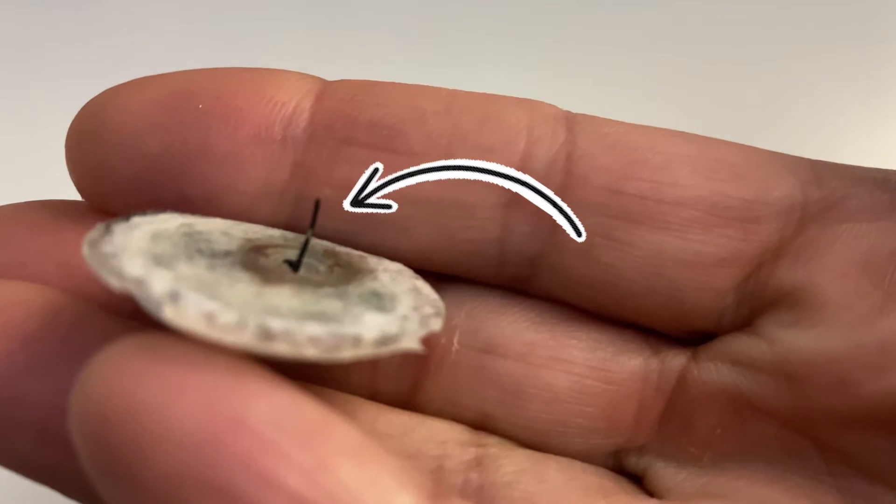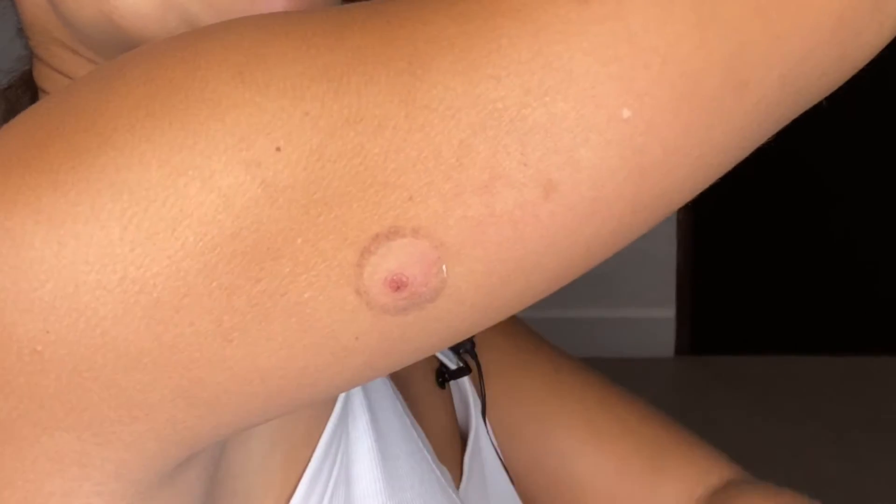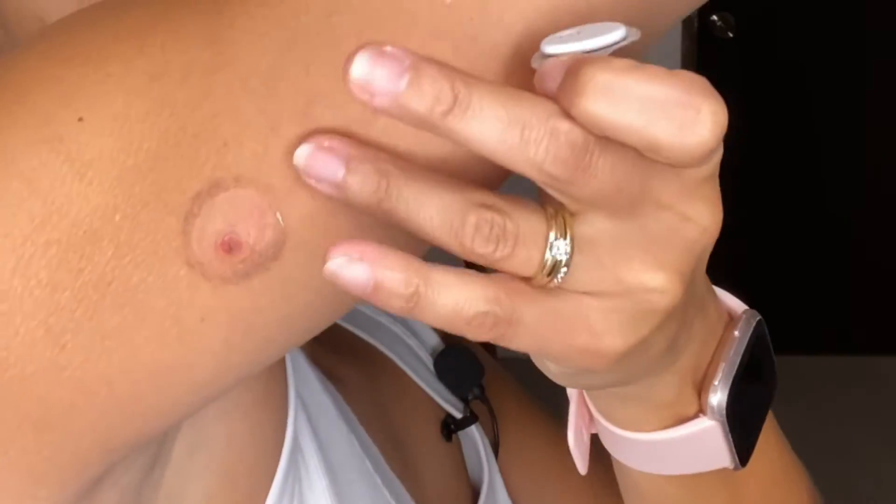However, the actual sensor part — the part that sits underneath the skin — seems to be a little on the thicker side, and it did leave more of a bruise or bump than what I usually see when I wear Dexcom.